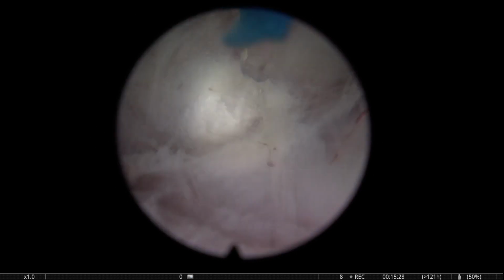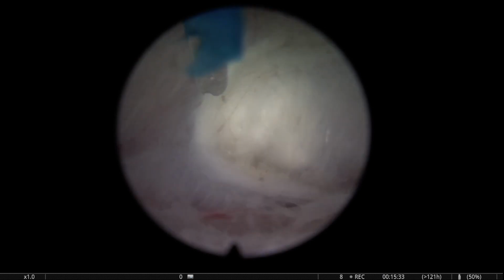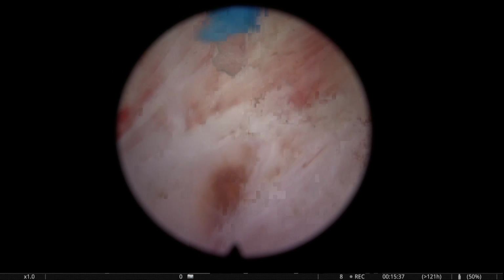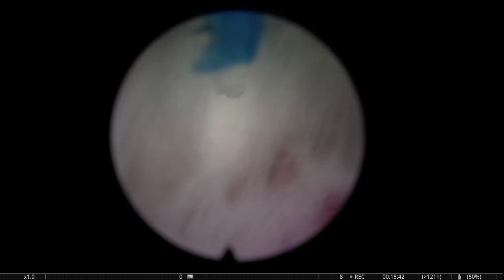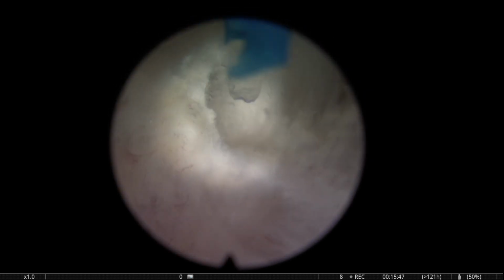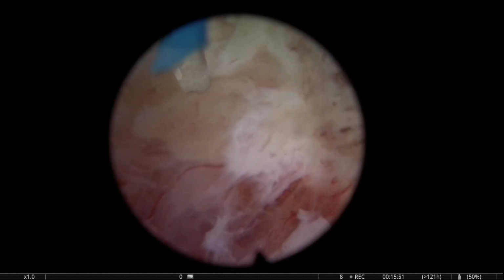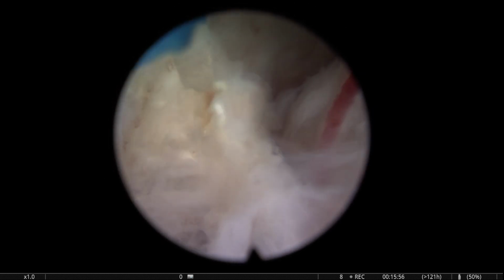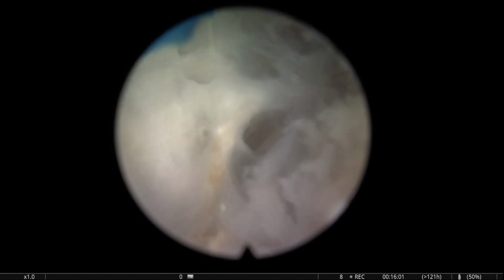But also, there's this concept that the peripheral zone of the prostate has no important function. You know what I mean? That we don't have to preserve the peripheral zone perfectly in every case, because of course there's people who think that when you deepen in the capsular plane, when you're going a little bit extra anatomic, maybe there is a little bit more discomfort postoperatively.